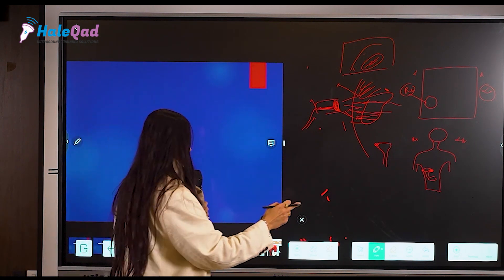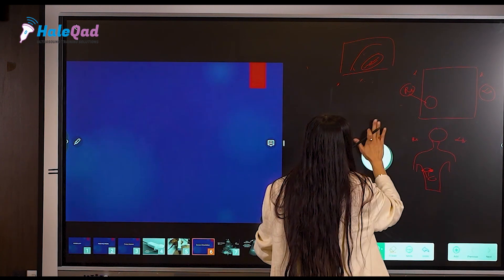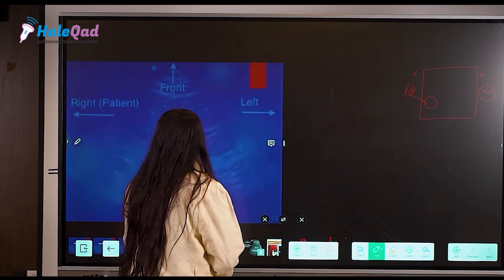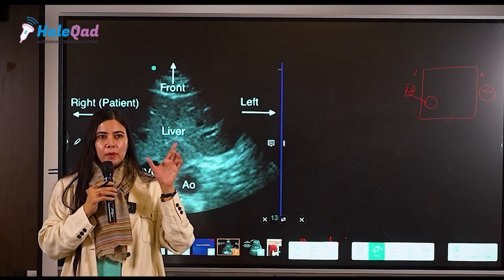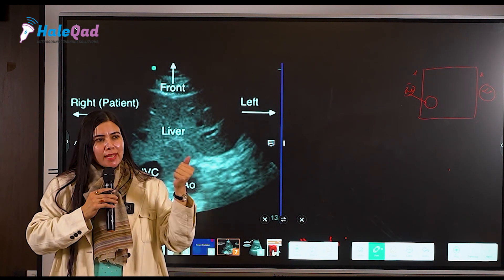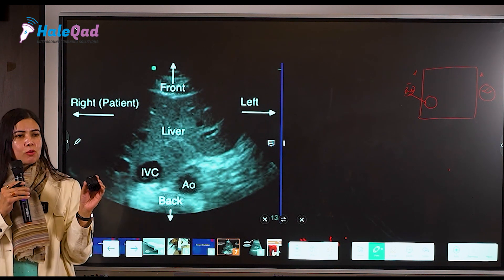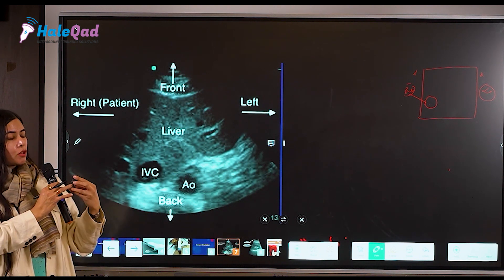Now talking about screen orientation. When holding the probe, there is a proper manner — don't grasp it too hard or it will keep slipping. Just hold it in a comfortable position, very gently and lightly. We will show you on the mannequin also. This is the probe — just hold it gently.